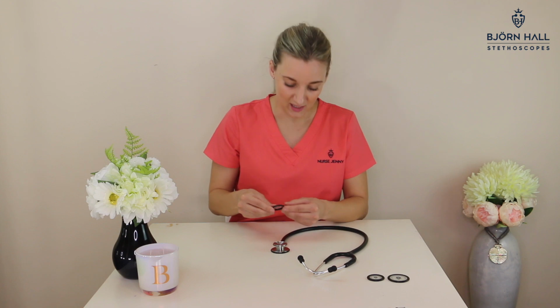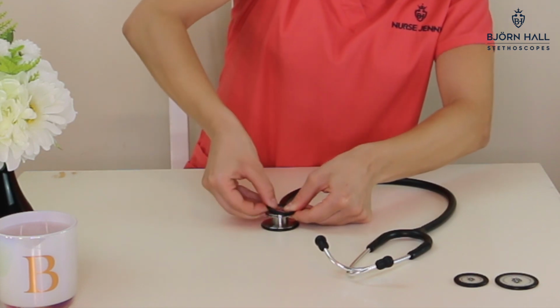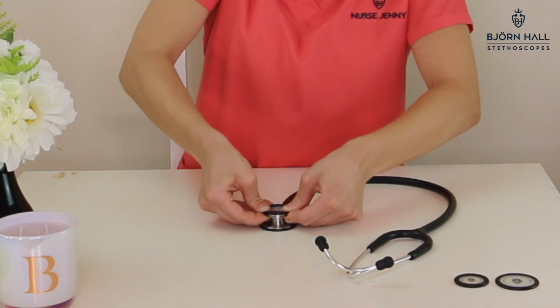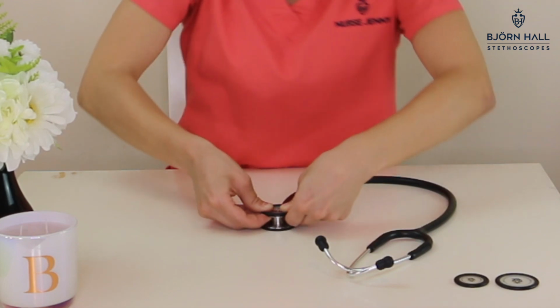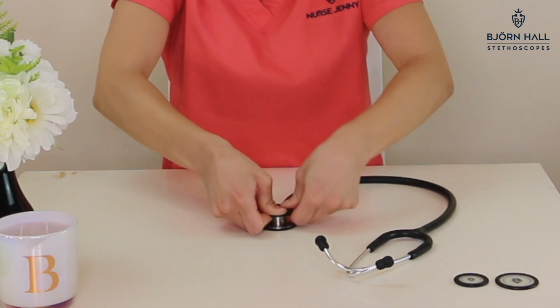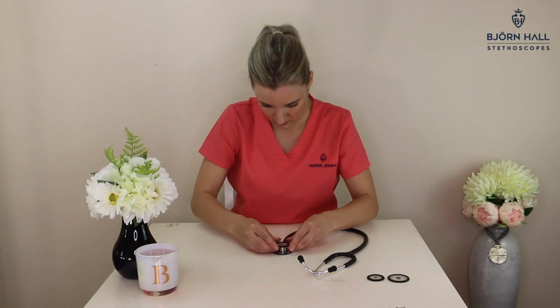You're going to do the same as with the large diaphragm. You're going to put it in on one side, hook it in, and then push down there. Get it pushed in on the other side, and then push all the way up. Walk it all the way up. Keep pushing all the way down. Make sure that it is a snug fit all the way around. Push them in. And there you go. You've popped your new diaphragms on.